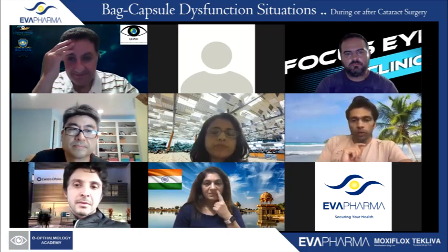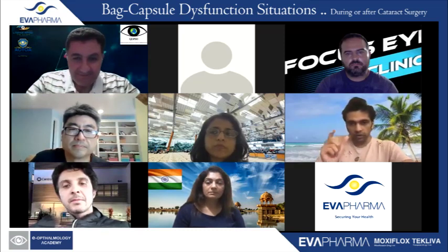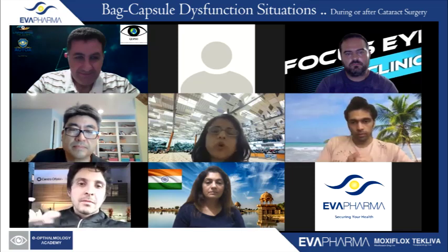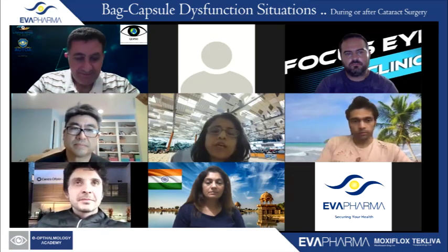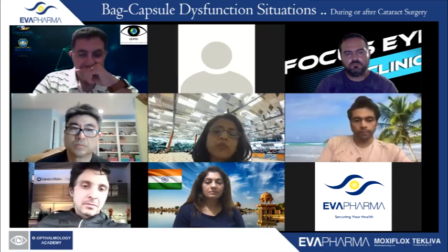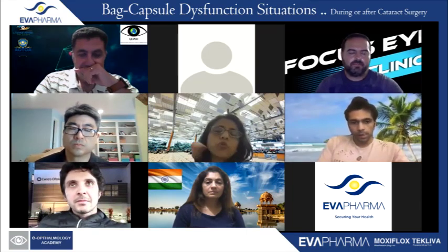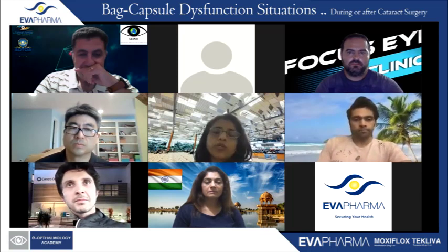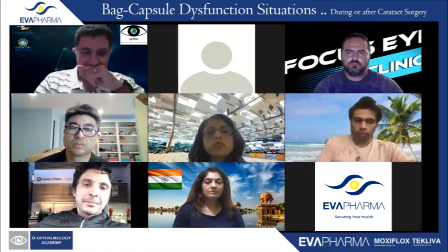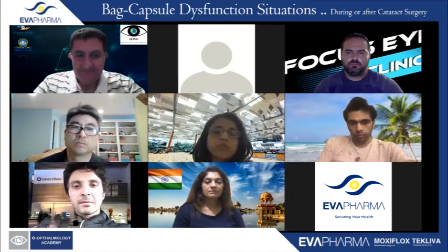Susan, one last question and we're moving on. 1.5 millimeters behind is your sclerotomy, or does that change in this procedure? You would actually keep it at around 1 to 1.5 millimeters, but you also need to get a visual impression of where the iris root is and where you're going to be putting your needle. So it would be a little different in high myopes. It would change a little bit. So get that visual impression and go slowly. That's why sometimes you would want to go ab interno rather than ab externo. Two reasons. One is you're sure that you're going in that plane. And second is that you know that you're not going to be hitting the vitreous chamber. If you're going ab externo, you definitely need to make sure that you're going horizontal. You don't go posteriorly, because that would cause a vitreous break anyway.